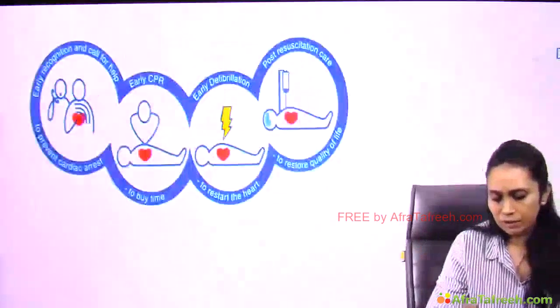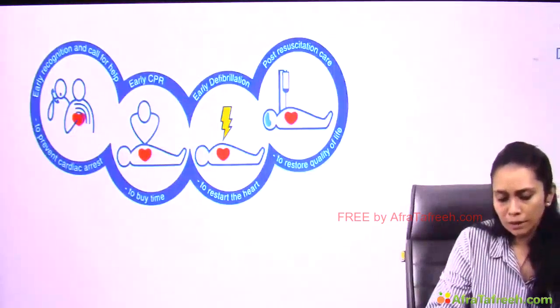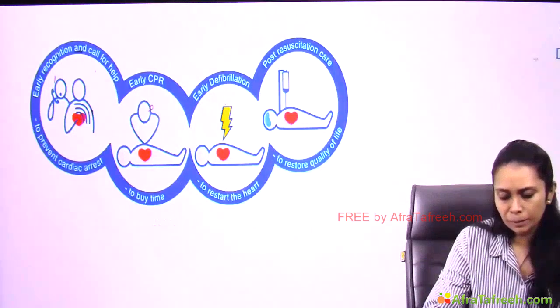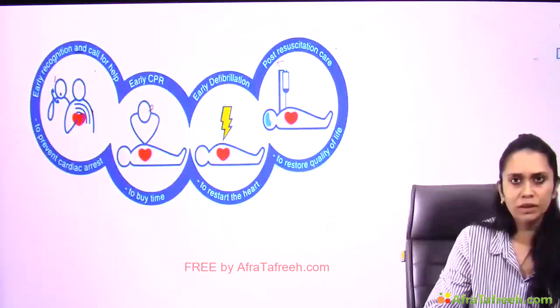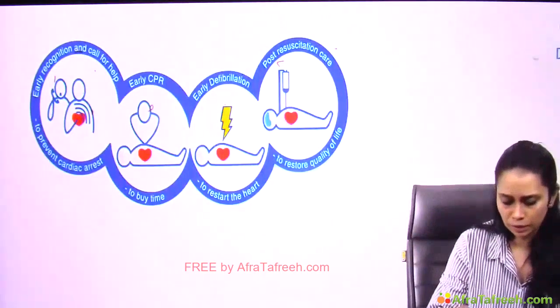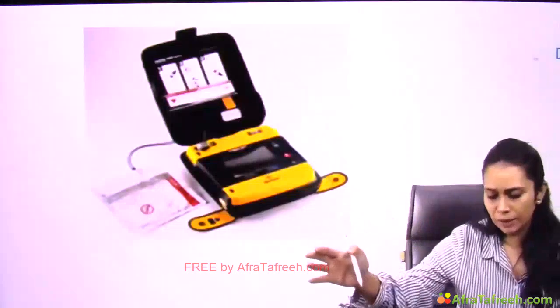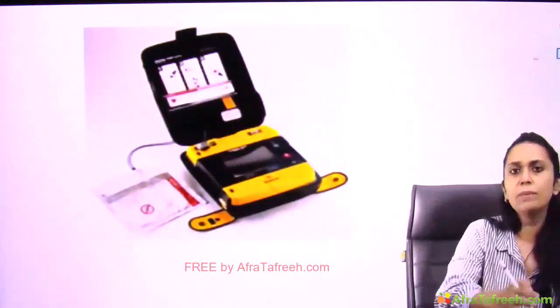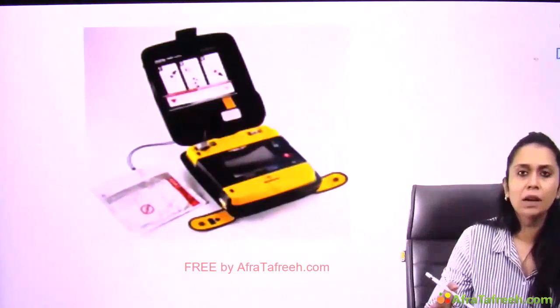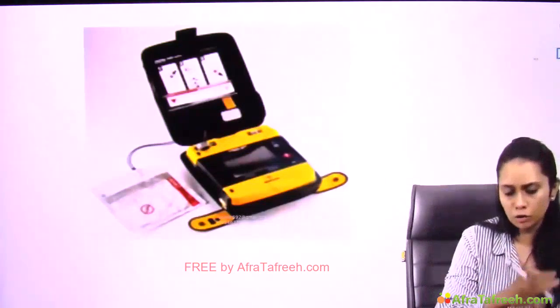Okay. Now this is the BCLS protocol: early recognition and call for help, early CPR, early defibrillation, and post resuscitation care. This is a circle of management in a cardiac arrest patient. Now this is AED, which I was talking about, automated external defibrillator. It has 2 parts, which are simply applied on the chest of the patient, and it itself recognizes the rhythm and gives a command that the rhythm is shockable or non-shockable.